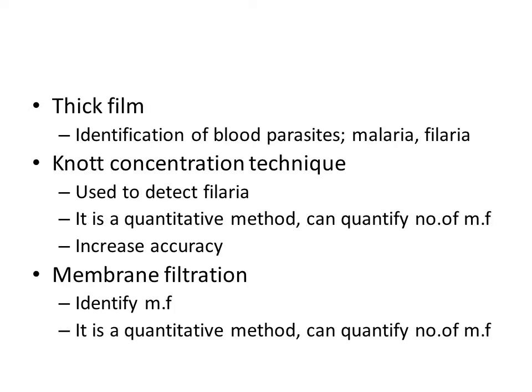Thick film examination. Here, identification of blood parasites like malaria, filaria and trypanosoma are examples. When we consider a thin film, we are taking a very minute amount of blood, that means a very small drop of blood sample, and we have to prepare a thin film.